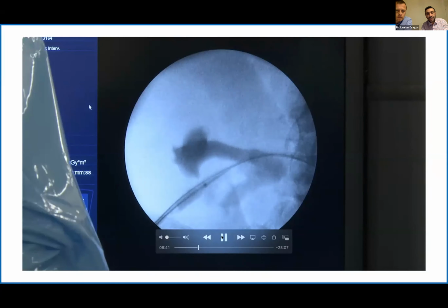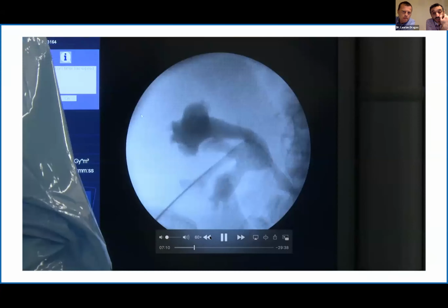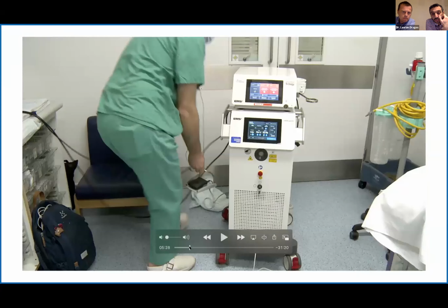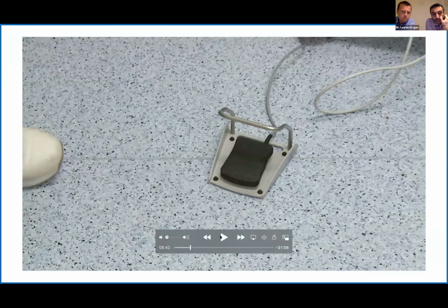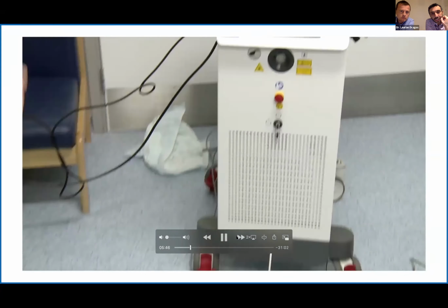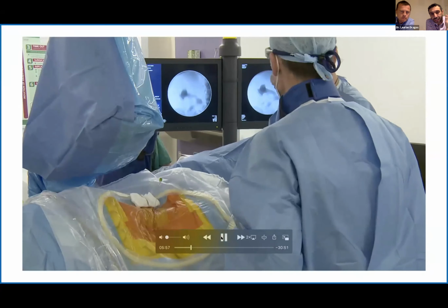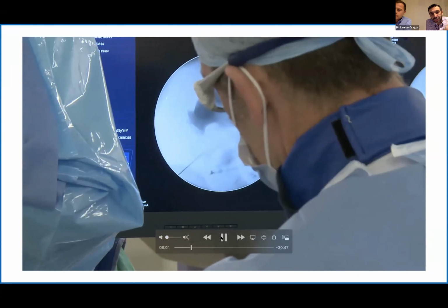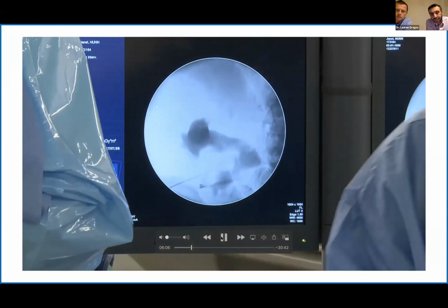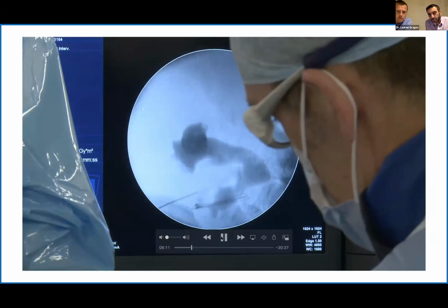One of the questions which has already come through was from Graham Watson, and it's a debate which is often had: should the radiologist gain their own access, or should it be done by the urologist? That's a very good question. In Cambridge, we're very lucky to work very closely with fantastic radiologists, where we discuss the cases beforehand in our stone MDT, before the PCNLs. We decide where is the best approach to get the best stone clearance. So it's not a case of the radiologist turning up and getting access where they can. It is a discussion with the radiologist.